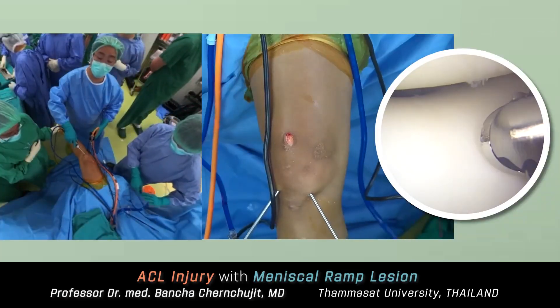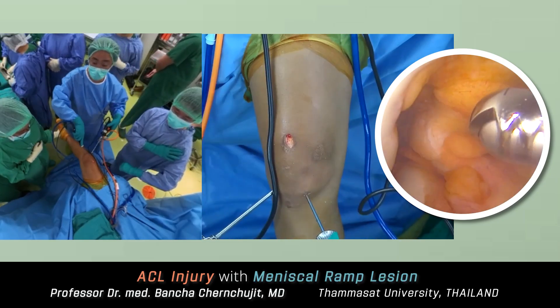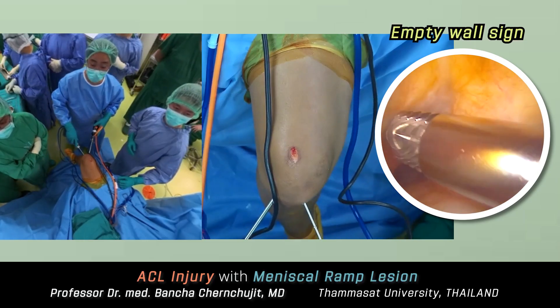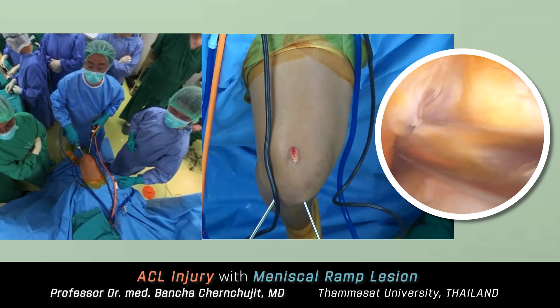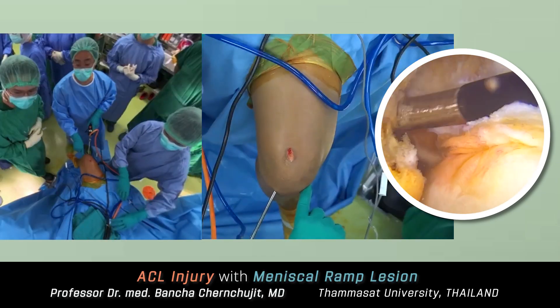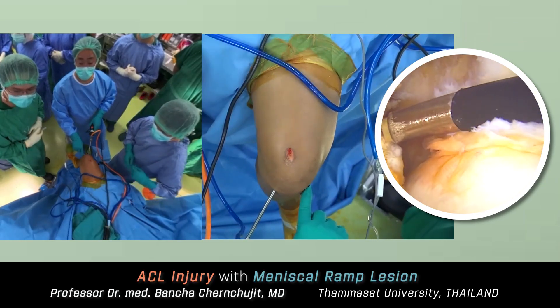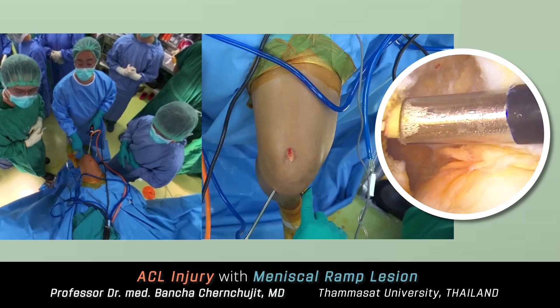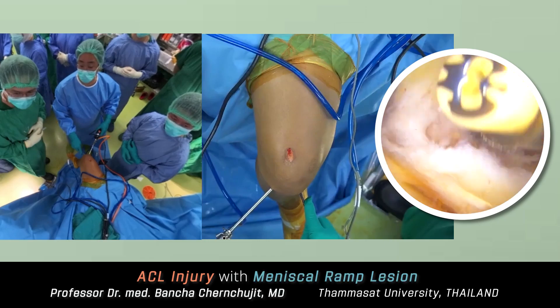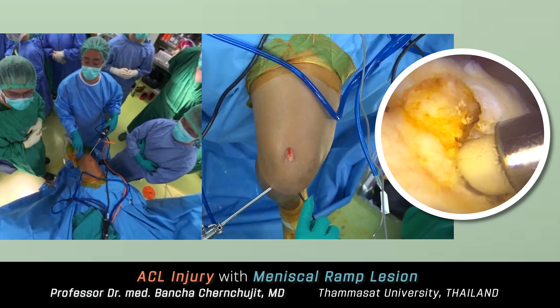I always go to the patellofemoral joint first — I call it the meeting room. We clean the Hoffa fat pad, then drop the leg down. You can see the empty wall sign, indicating that the ACL is gone; it's been six months since this patient's injury. Here is the previous ACL femoral attachment. I prefer to create the femoral tunnel lower to occupy the space covering the femoral footprint. I also identify the tibial footprint, which I will discuss later.